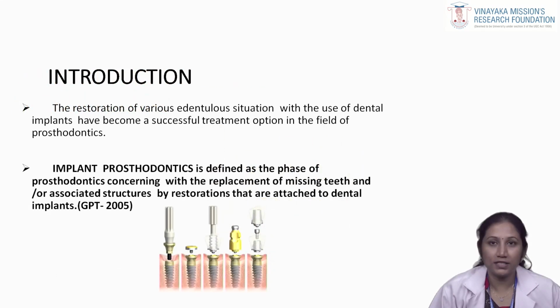Today my topic for presentation is components in implant dentistry. Implant dentistry is a boom in the field of dentistry. It is a successful treatment option for the replacement of missing teeth. According to the Glossary of Prosthodontics, implant prosthodontics is defined as a phase of prosthodontics concerned with the replacement of missing teeth or the associated structure by restorations that are attached to dental implants. The aim of today's topic is to introduce our students to the various components of implant dentistry.